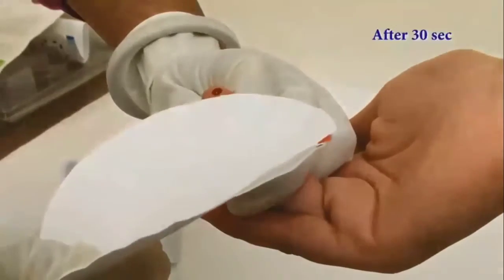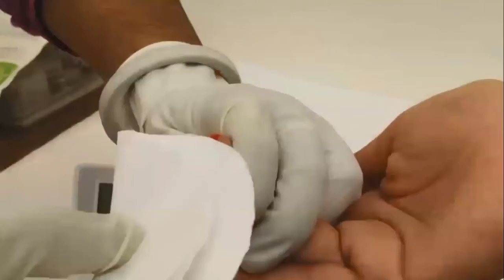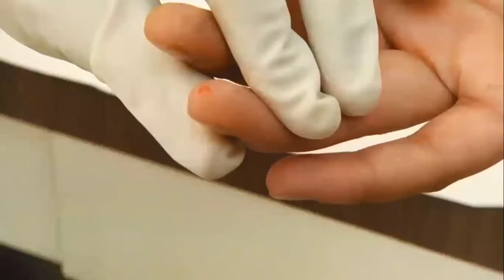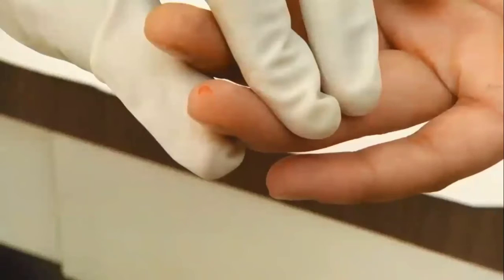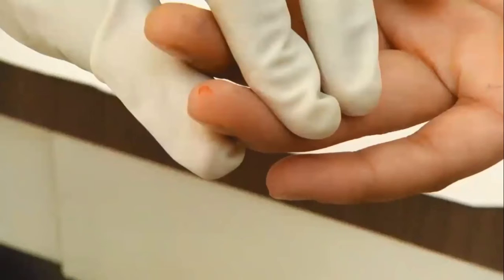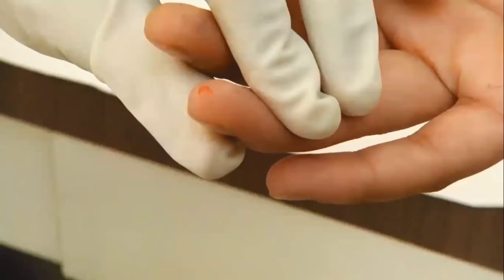After the stopwatch is started, the edge of the filter paper is used to wipe the bleeding area — not on top of the bleeding, but only the edges of the bleeding point are wiped by the filter paper. It is wiped after every 30 seconds until the bleeding completely stops. When the bleeding completely stops, the stopwatch is also stopped and the time is noted.